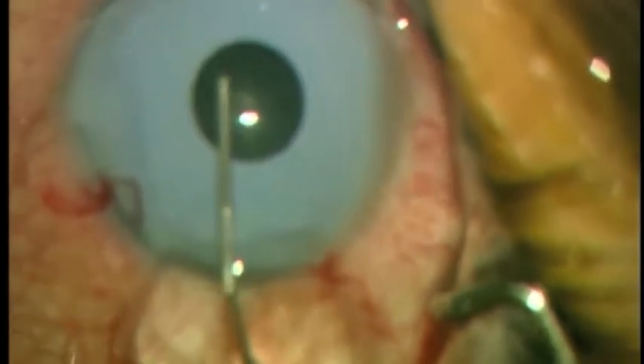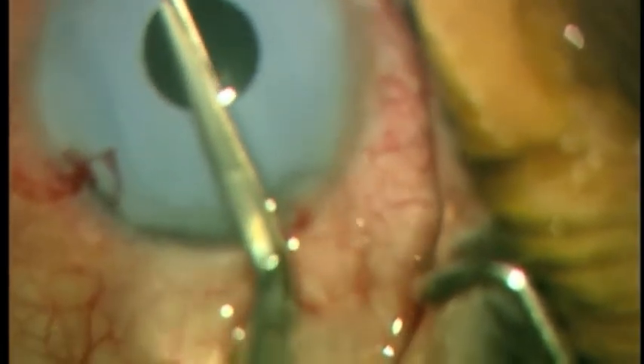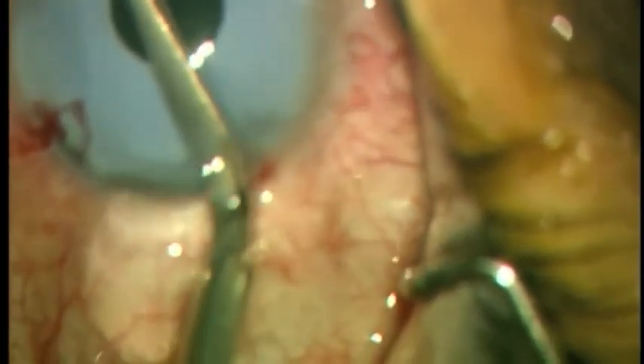Cohesive viscoelastic is inserted into the anterior chamber and an attempt is made to separate the implant from the iris below.